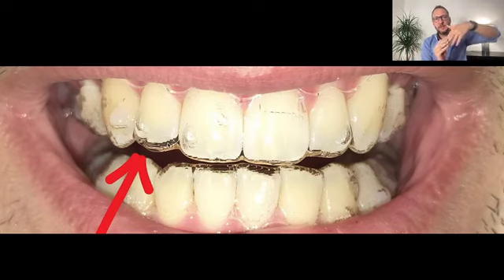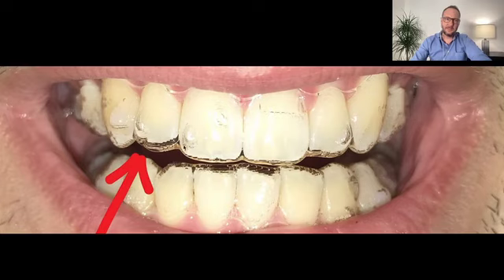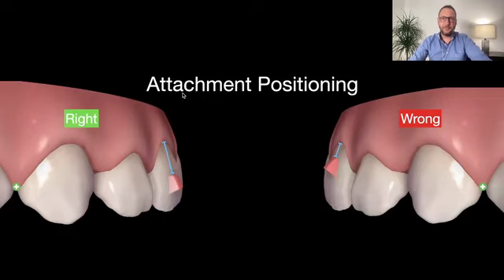As soon as we start moving, this pressure in the incisal part of the crown starts creating an intrusion component of force, and then we start losing tracking, and this is a very good example of losing tracking. The crown was supposed to be here, well adapted to the plastic, and it's there, so we have almost 1 millimeter of distance where we lose tracking, and then we need to know how to recover this. We're going to have a whole session here to discuss troubleshooting, how to solve this kind of problem, but stay tuned.